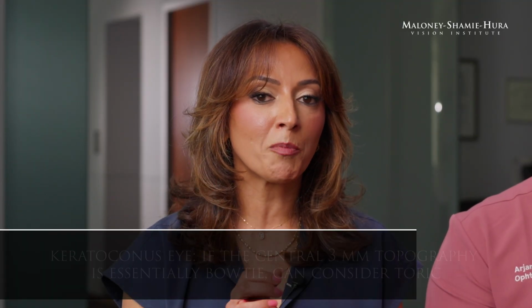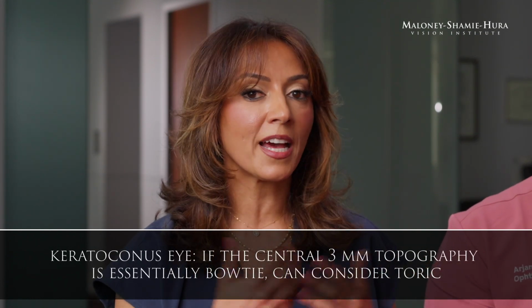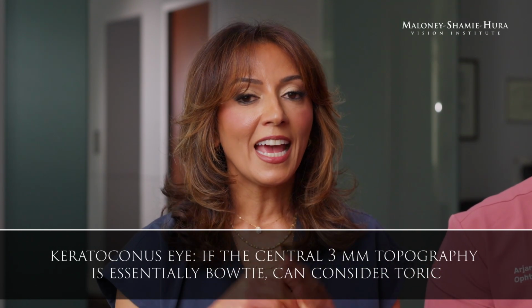Let's talk about keratoconus patients. A keratoconic who has severe keratoconus would not be a great candidate for many of the premium lenses except for potentially the IC8, but even that lens has its limitations. But then there are keratoconic patients who have astigmatism that's essentially bow tie in the central 3 millimeters of their corneal topography, for whom we would consider, would you agree, a toric lens or a light adjustable lens for those patients. And lastly, let's move towards the back of the eye.